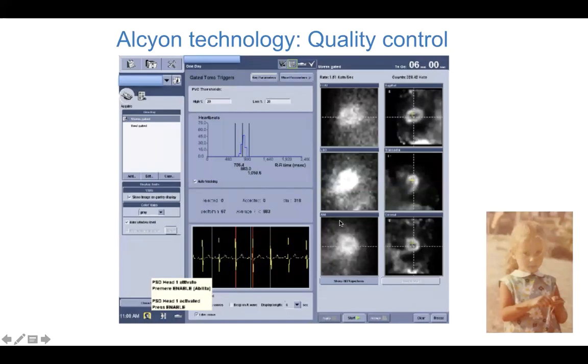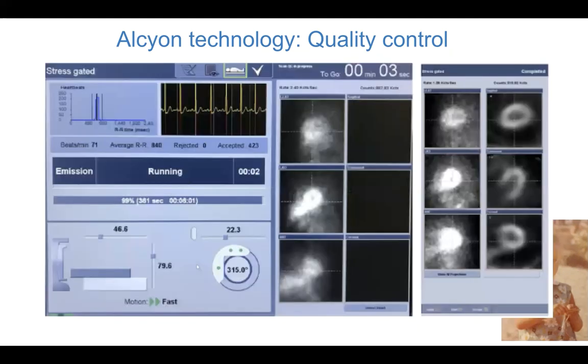The last step is the use of the contours to superimpose the threshold contours from the top scan slices on the bottom slices for the correct assessment of myocardium position alignment. The gated quality control screen displays average heart rate, accepted and rejected beats, a curve depicting total counts before and after gated beat normalization, heart rate during acquisition, and RR distribution. This is an example of before and during the acquisition.